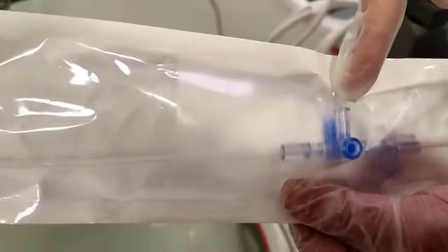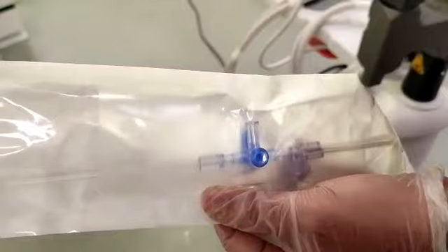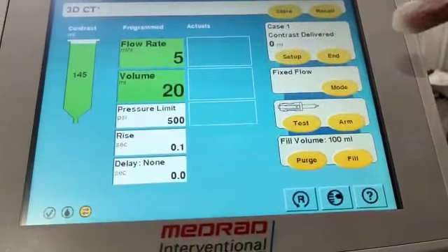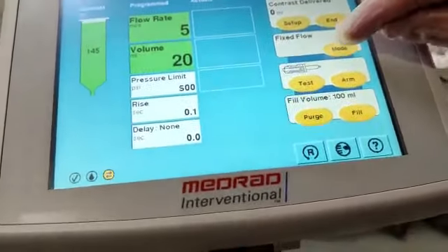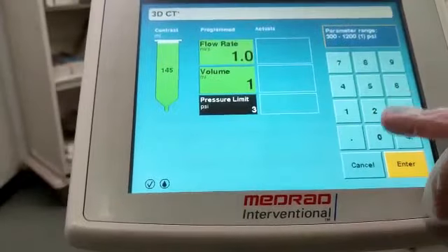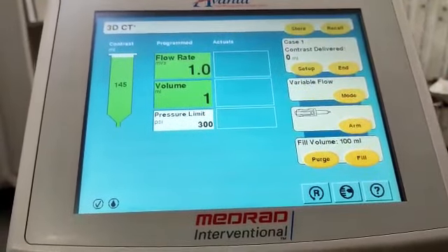One limitation of this machine is that it does not have a pullback system, unlike the previous Medrad Mark 5. That is why there is a three-way stopcock port — you can aspirate manually from there to remove air or bubbles before connecting to the patient. Once you have aspirated and confirmed it is air free, you come back to the screen, select your desired mode — fixed flow for vascular angiogram or variable flow for coronary — and always double-check the parameters with the doctor before injecting.